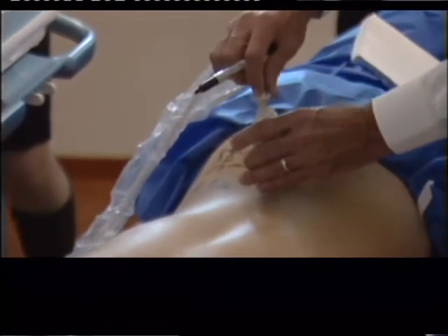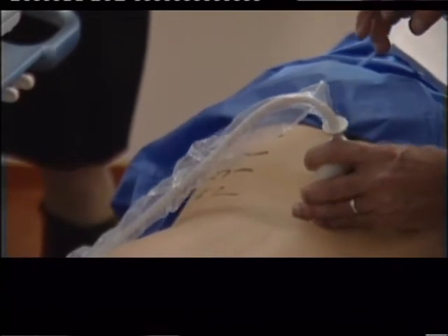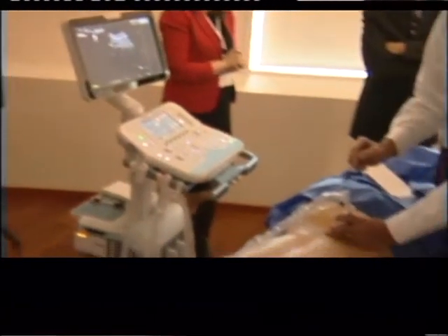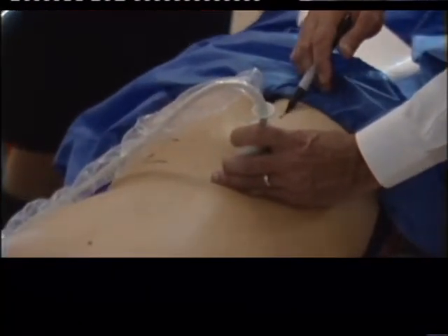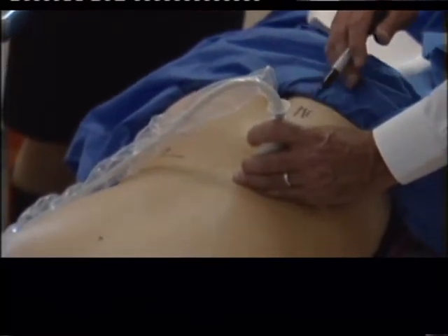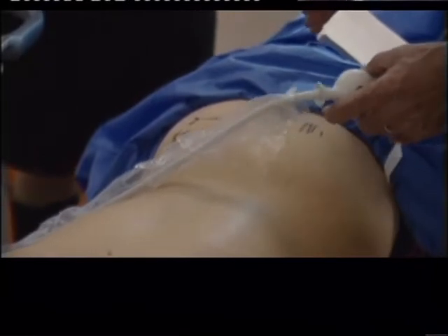And what I do many times, I go here, let's go on this side. I can check 5, 4, 3, see, 5, 4, 3, and I can say lamina, facet, nerve root, transverse process. So it's very close.